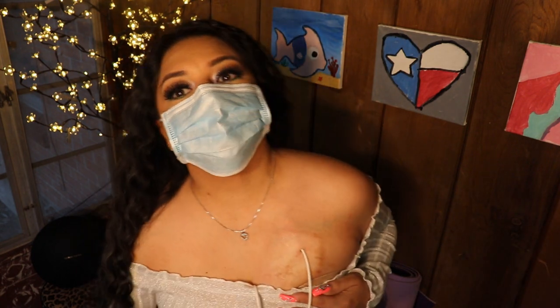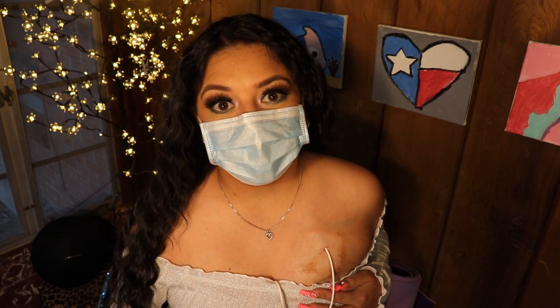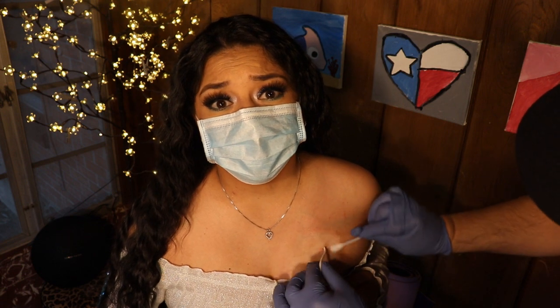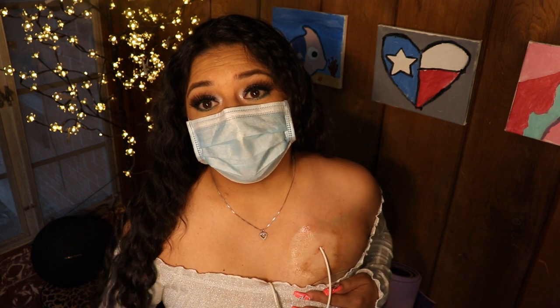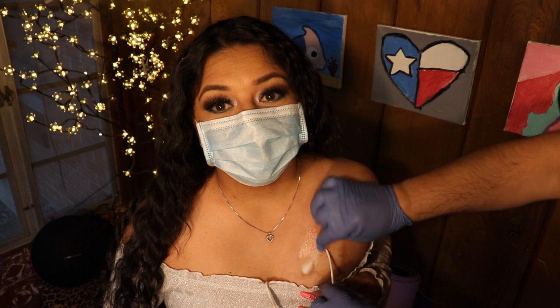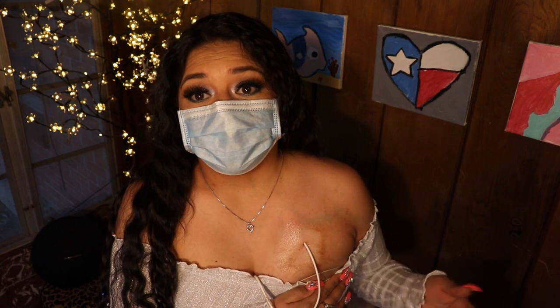If you see any darkness, it's previous scarring from the chemical burn that I have on the skin. I've had this on for almost five years — going on five years this June. The mixture of both of these chemicals sometimes creates skin burn, and that's what the darkness around is. I've had it for a very long time and I've had the same one. I haven't had any infection on it, thank you Jesus. But we take really good care of it. Anytime you go outside, you're sweating, you have a stressful day, and you're moving around a lot, you've got to make sure that you keep this thing straight and awesome.